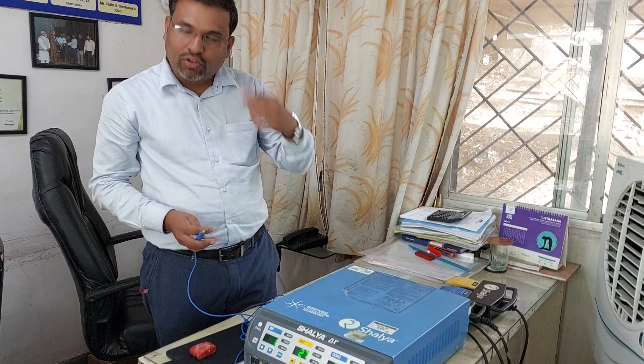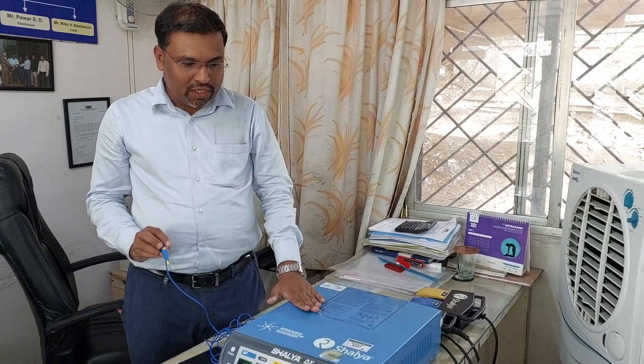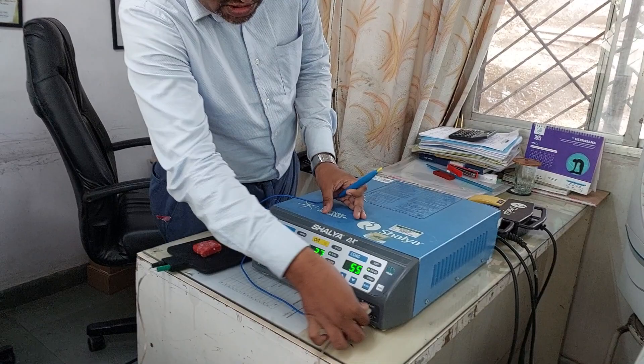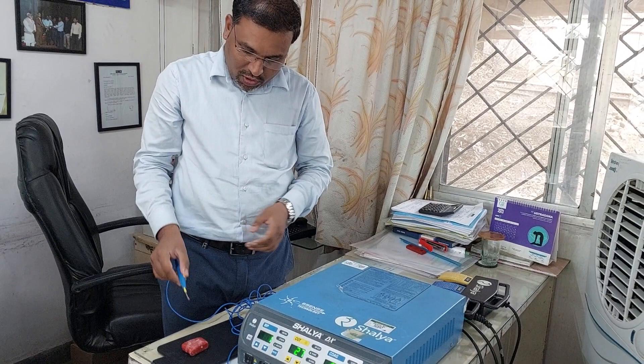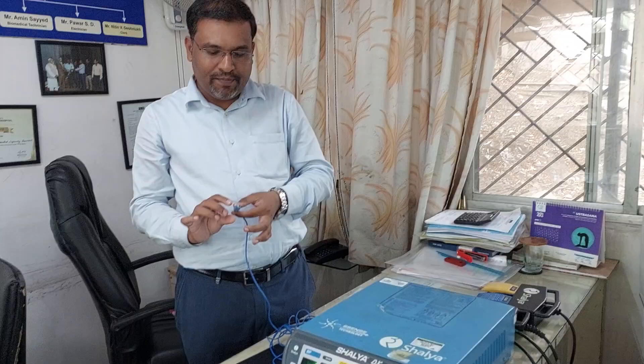Some basic precautions: when holding the cutting electrode, never touch the open surface as it may cause a shock. The cautery must be properly grounded so any leakage current goes to ground. Very importantly, if the patient plate is not connected properly and the cautery is accidentally activated, there is a risk of shock to the patient.